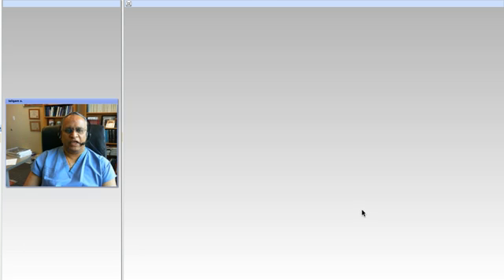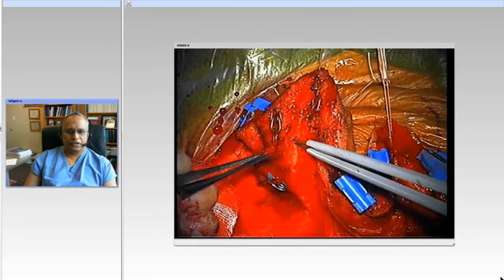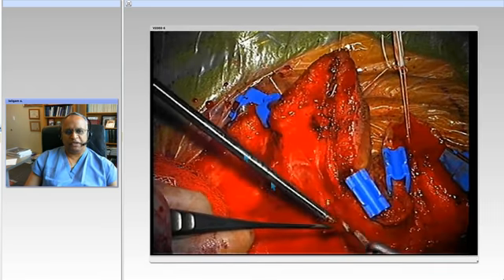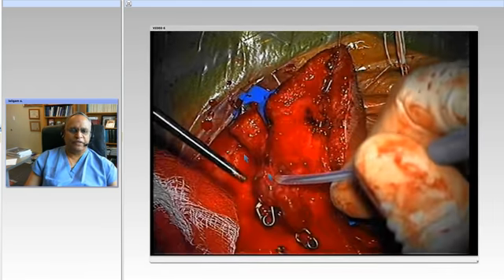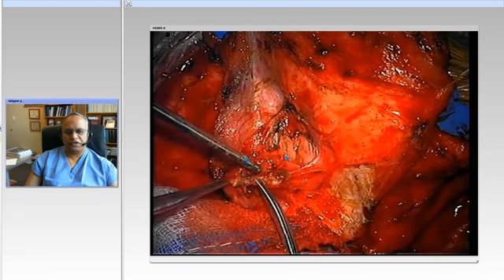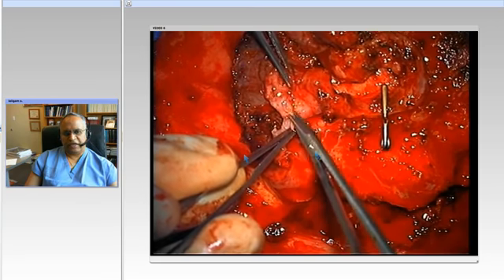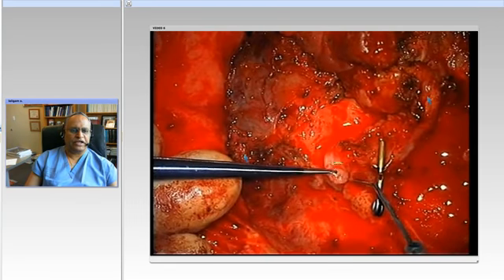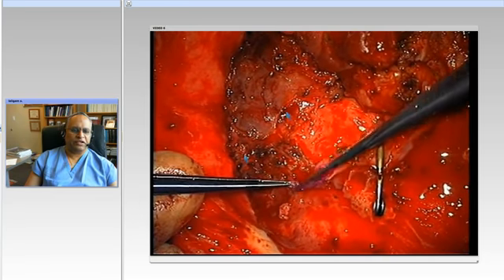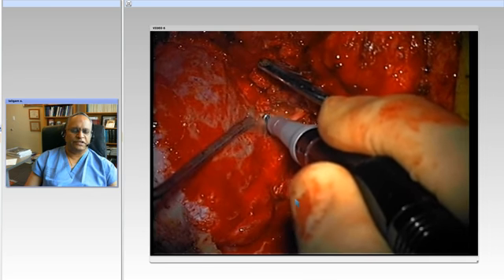and we have a right-sided far lateral approach, dissecting the occipital artery from the flap. Sometimes it's one of the most difficult techniques, which can tax the surgeon's patience. You have to start preferably distally, then come back down, and then you have to trace it right to the digastric groove. And here I'm just checking the vessel, making sure that it's okay, and marking the terminal ends.